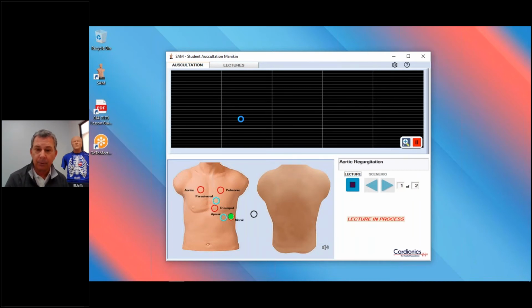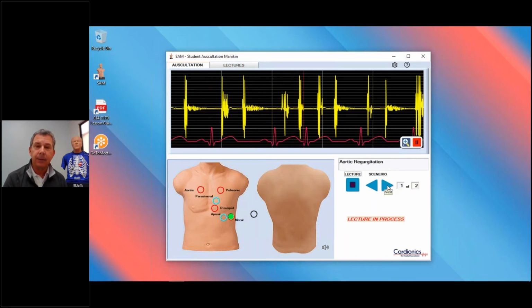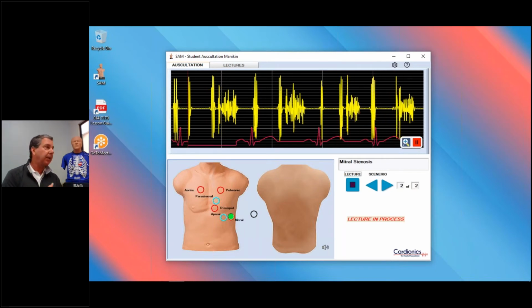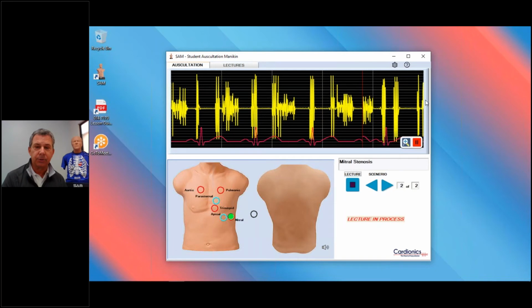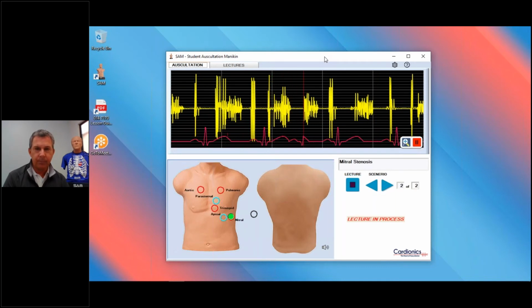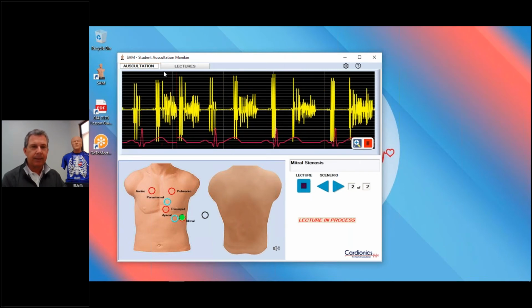In this case, it's aortic regurgitation. That will play. And when I'm done with that scenario, I can move forward and it'll play the next sound, which I had put into my lesson, which is mitral stenosis. And so you can hear that. Based on whatever content you're teaching related to auscultation, you can create your own lesson, which is really, really exciting. So again, you can hopefully hear that.